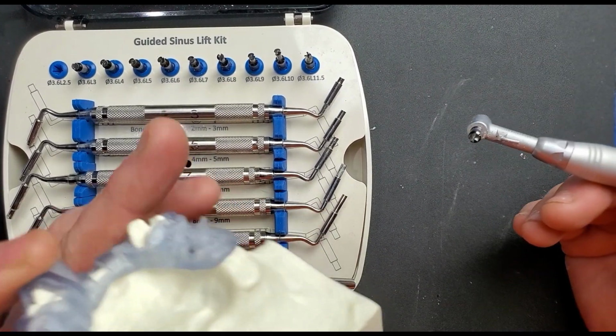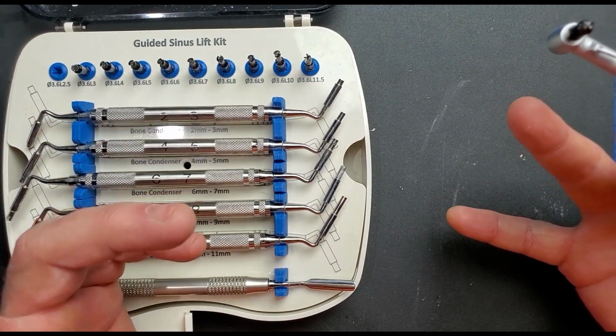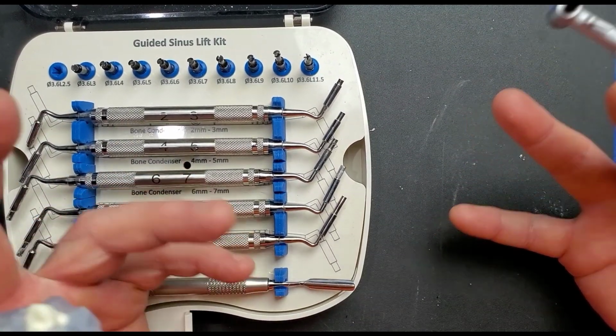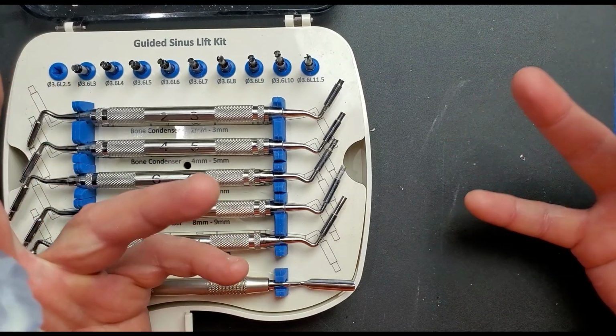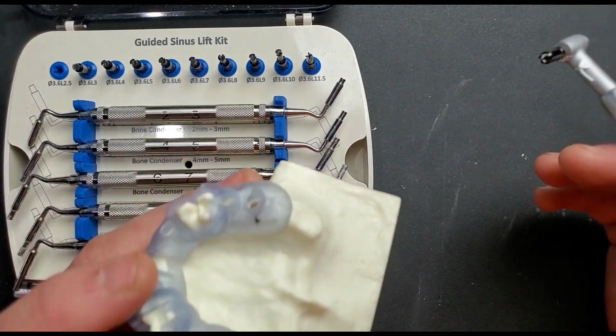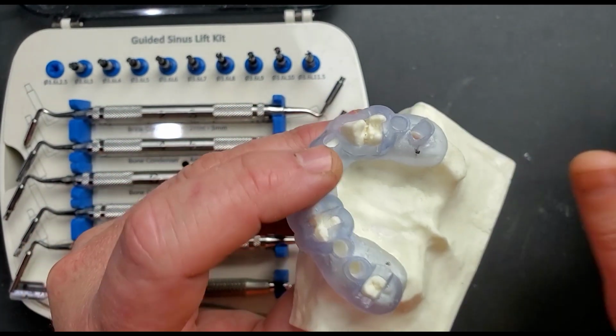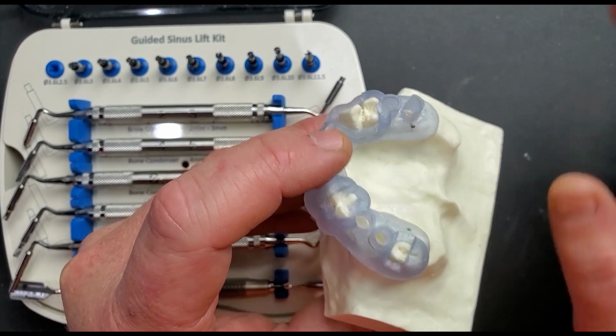Now, since it's 2.5 millimeters, you wouldn't want to use this in a sinus where you only have a couple of millimeters of bone, or maybe just a single millimeter, like an eggshell sinus. This would not be the ideal scenario to do a crestal lift. So here we've got plenty of bone. If you've got 3 to 4 millimeters of bone height, then you should be great to use this kit.